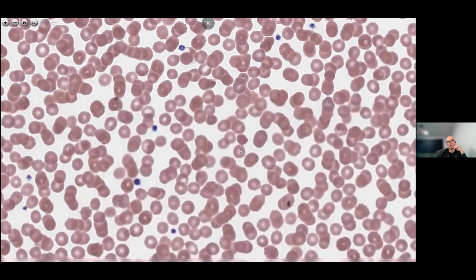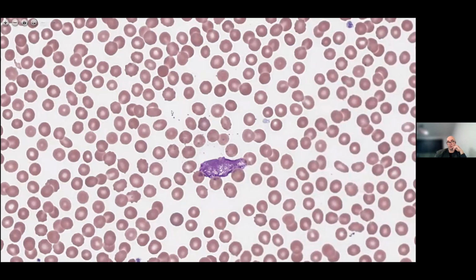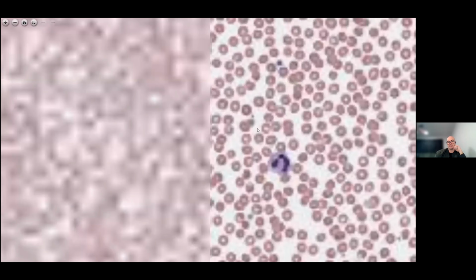So we'll move on to assessing the red cells. And if I see any other white cells that I believe have significant morphology when I'm scanning about the film, I'll stop and I'll point it out. But the red cells, there's a small central pallor area, central pallor. So they look normochromic. And we don't have an MCV, but it might take me a bit of time to find a small lymphocyte. So we're just going to presume for now that they're normocytic, so they're normal in size.